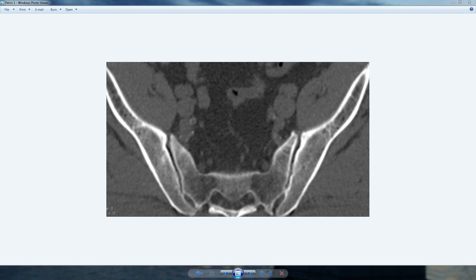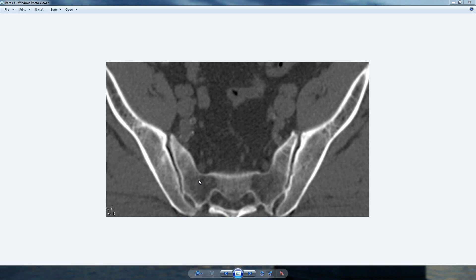On a CT scan, you can see these different types of bones. Take this CT scan of the pelvis for example. The hard and dense cortical bone is seen as this white outline. The bone is bright white, which indicates that it is very dense. The less dense and fatty bone marrow containing spongy bone can be seen within the center of the iliac bone here and the sacrum here. This bone is not white, but rather a grayish color. In some areas, it is approaching black in color.